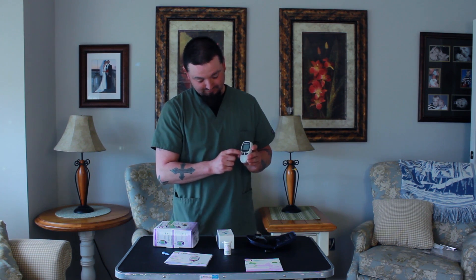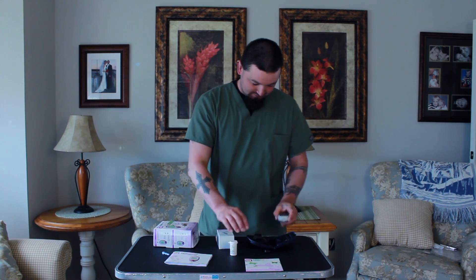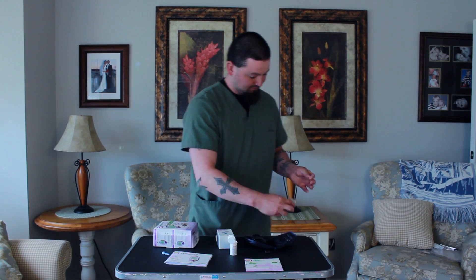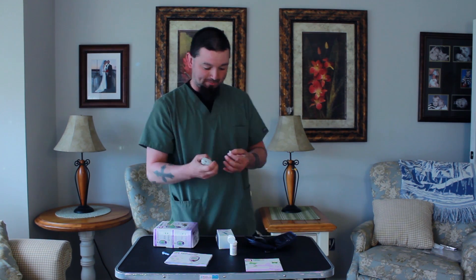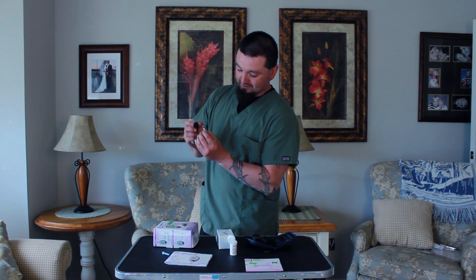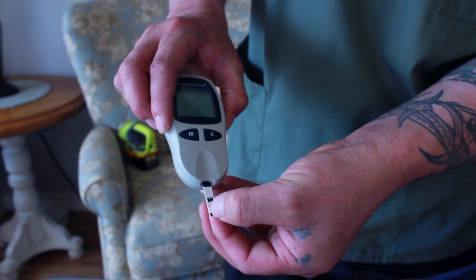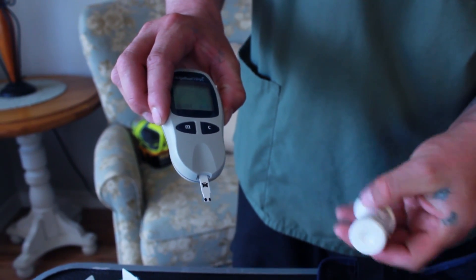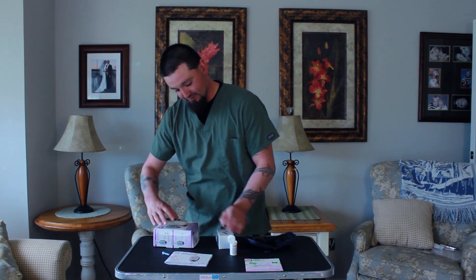You have a monitor that you'll turn on and at that point you'll adjust it accordingly to your strip. The machine doesn't turn on until you insert your strip. I like to think butterflies fly upwards, so that's the way you're going to insert it into your monitor. As soon as you push it in all the way, the monitor will turn on and you'll make sure the code matches exactly to the code on your box.